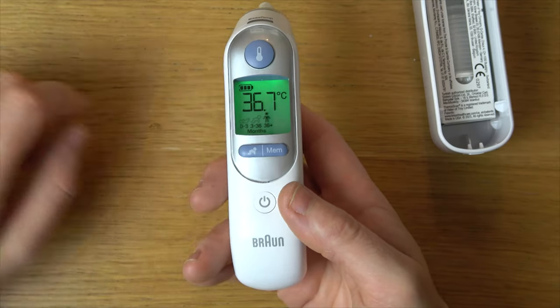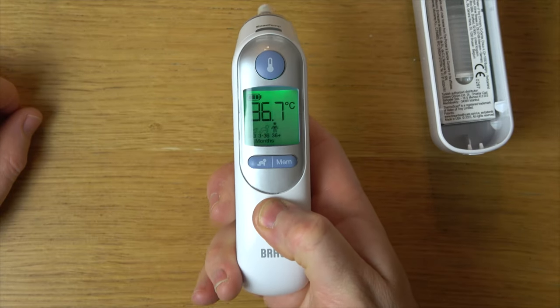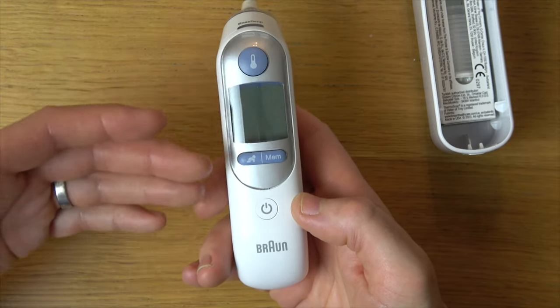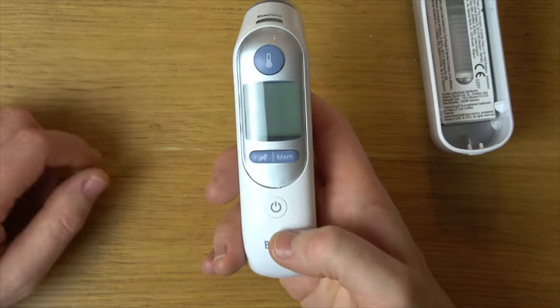If you're wondering how to change between Celsius and Fahrenheit, it's really easy to do. Right now we're in Celsius, we're going to turn it off, and when it's off we're just going to hold down the power button, and it will keep cycling through from Fahrenheit to Celsius. You let go when you're at your chosen temperature.